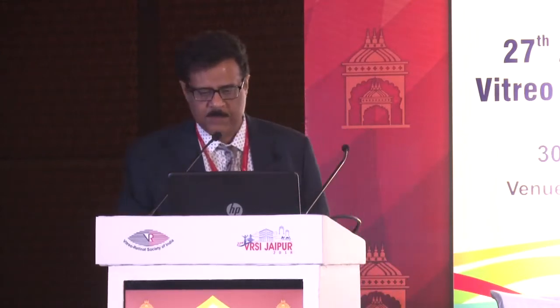Now you can see the foreign body is absolutely released from the trapped situation. You can remove the foreign body from the limbal route. Basically, I had done the lensectomy beforehand. It's quite a large and thick foreign body. After doing fluid exchange, you do laser, and at the end of 4 months, after removing the silicone oil and intraocular lens implantation, the patient gains 6/9 vision.